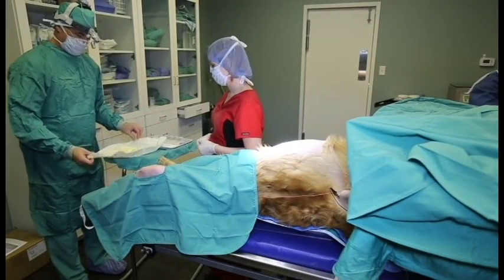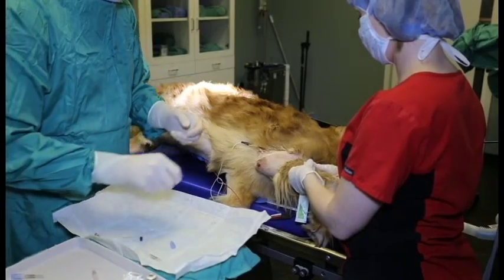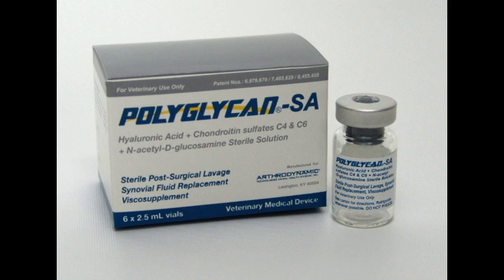Sterile gloves are opened and put on. The open glove package is utilized as a sterile field to place the syringes and needles to maintain asepsis. The use of an assistant allows maintenance of asepsis and presentation of the joint to facilitate needle placement. Assistance with needle attachment on the syringe and loading syringes with polyglycan SA or IRAP is also facilitated. With the joint positioned appropriately, use the hand opposite the needle hand to establish anatomical landmarks and needle insertion.